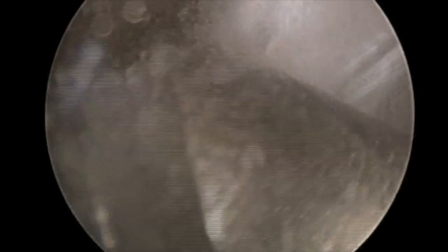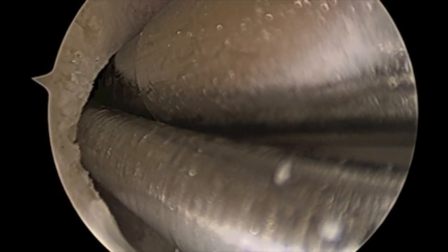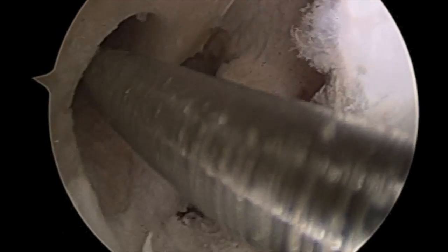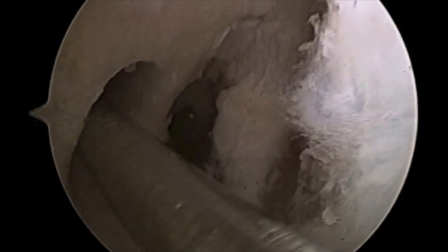The reamer is then removed from the knee. An arthroscopic shaver is then introduced into the medial portal with care to resect and remove any remaining debris within the femoral tunnel.